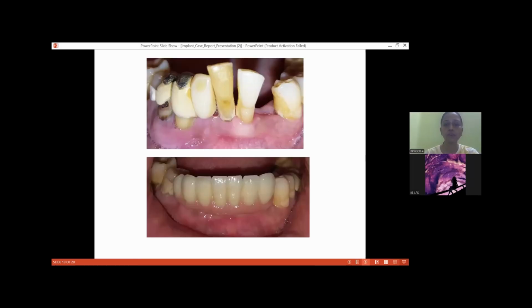This was the before and after of the patient photos. Before, there was a grade 3 mobile 3-1 and 3-2, and also an ill-fitted fixed prosthesis, and also secondary caries in relation to 4-4. But later we provided a better functional and aesthetic rehabilitation in the lower anterior teeth region using placement of implants after the socket preservation and healing.